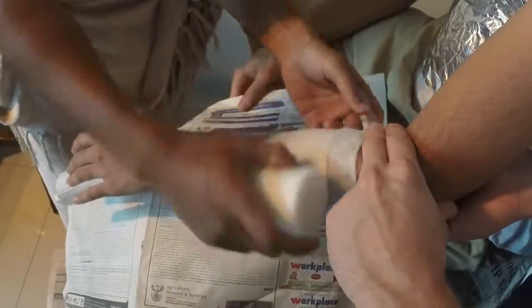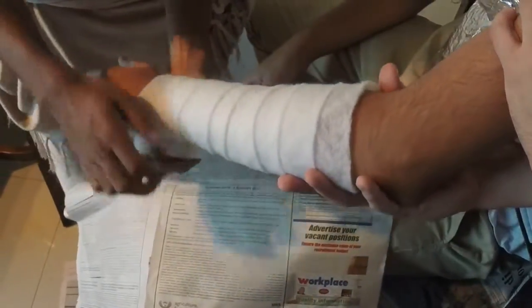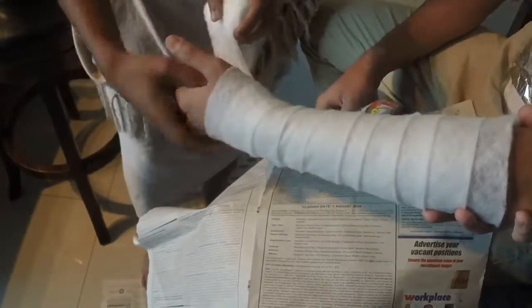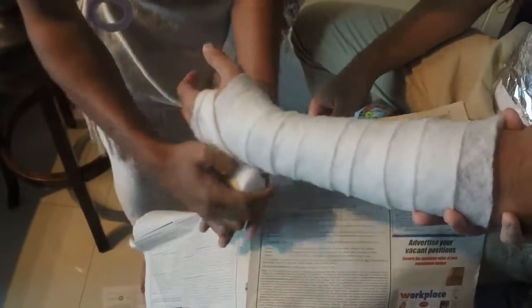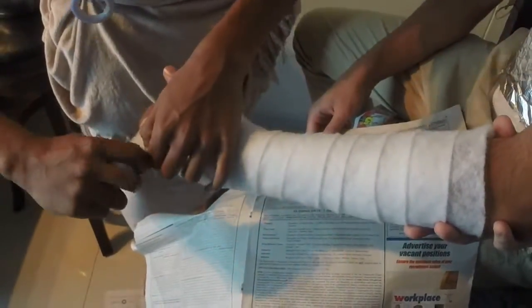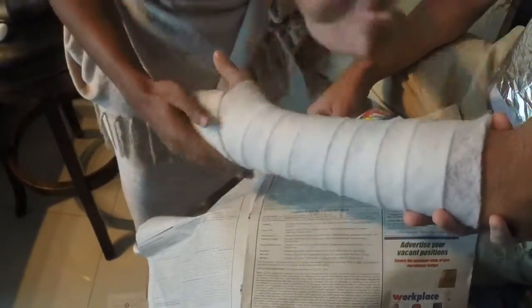It's important to start two centimetres below the elbow joint when applying the felt band for a below-elbow cast. The felt band should be applied in a 50-50 overlap fashion, as demonstrated in the video. Approximately one to two layers should provide sufficient padding, and it's important to take care to pad the bony prominences as well.